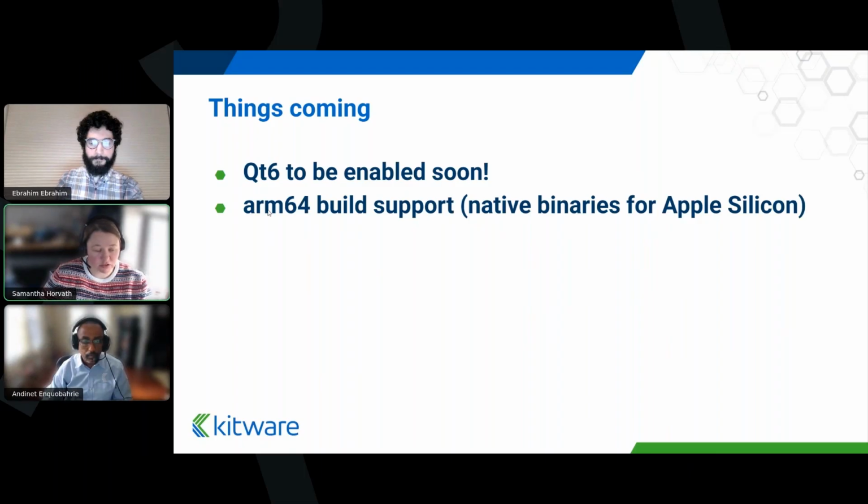And that has actually worked quite well for us, so we've been able to avoid having to dip our toes into building on Apple Silicon while things are still experimental. But with the Qt6 transition, that's going to greatly simplify the work that we need to do to support ARM64 machines. And in the near future, we'll be distributing 2 binaries for macOS, one for Intel-based systems and one for the Apple Silicon.